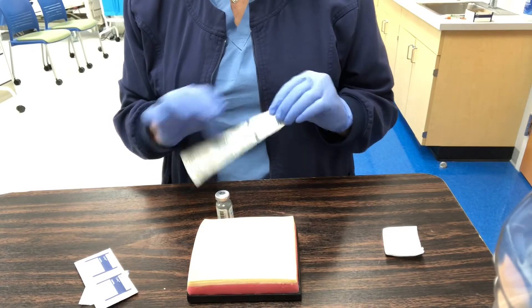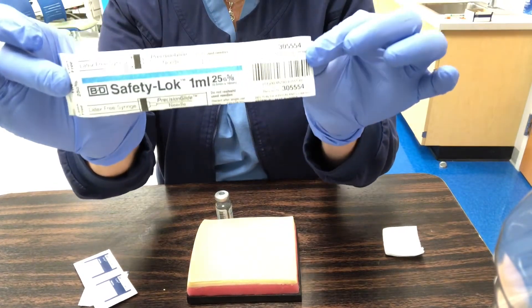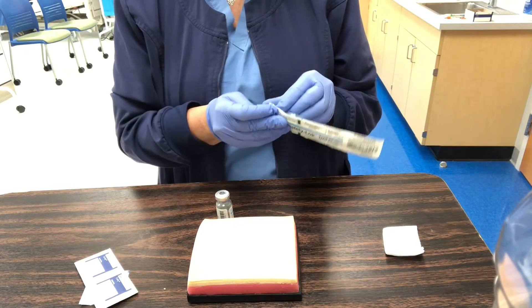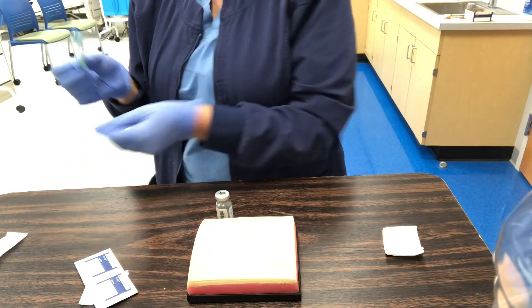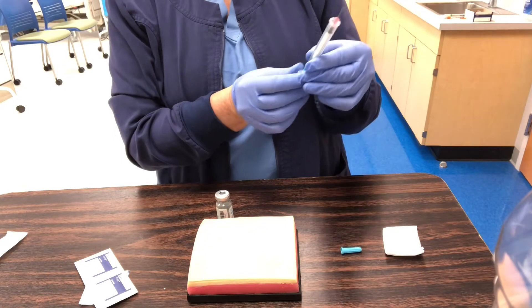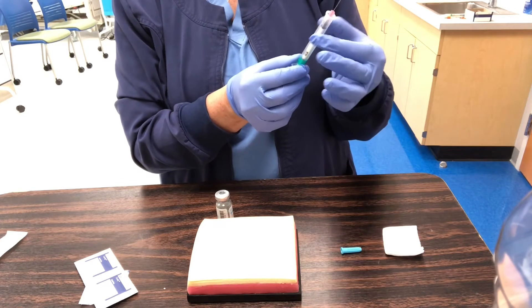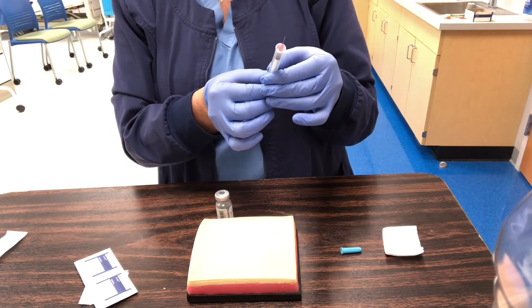I've picked a TB syringe to do my intradermal injection. That is normally a very small needle and only a one-milliliter syringe. I'm going to open it, remove it from the packaging, take off the cap, and draw down. I'm going to give 0.1 mL. TB syringes have very small dosing increments so that you can get very accurate dosing.